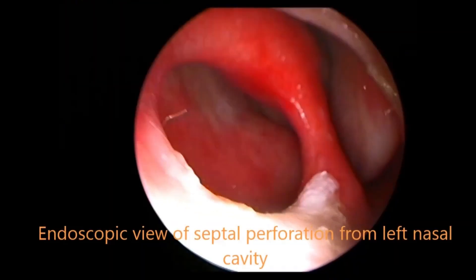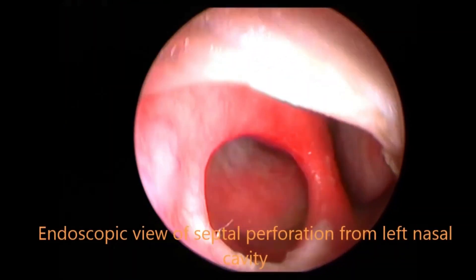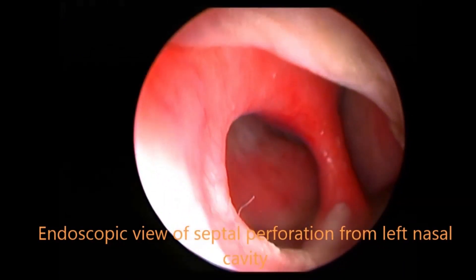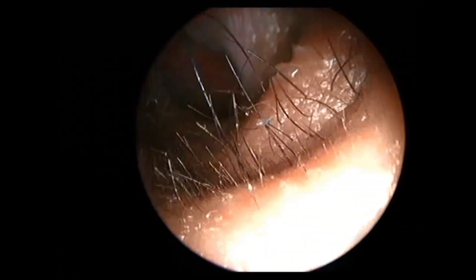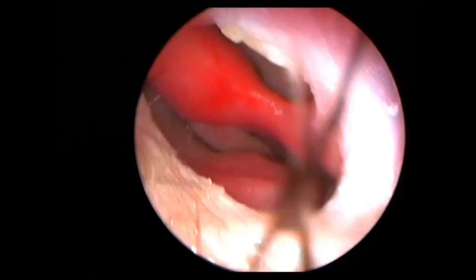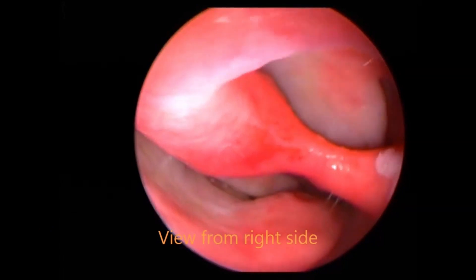One case which had previously undergone SMR at another center came with a complaint of whistling sound, excessive crusting, and bleeding, and on examination you can see there was a septal perforation.